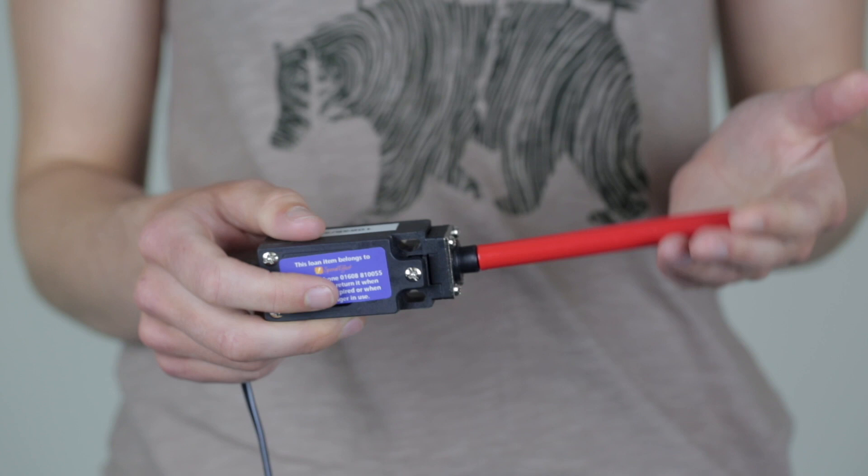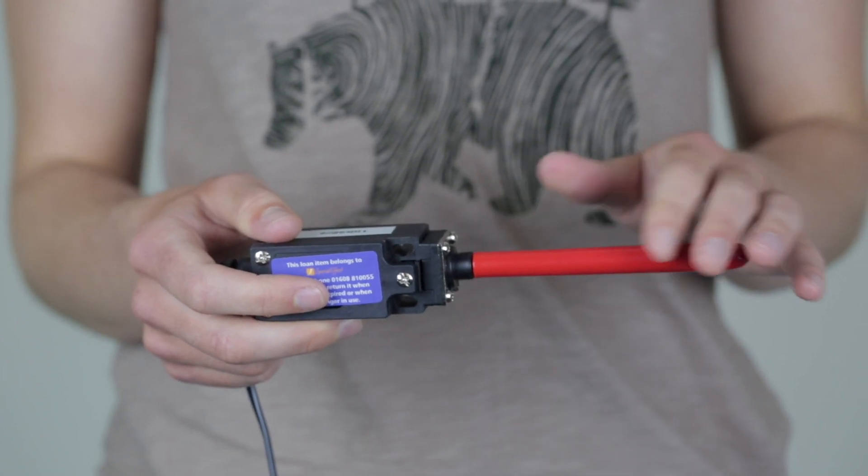Any accessibility switch with a 3.5mm jack should work in the Xbox Adaptive Controller. Here are some examples of other switches that we use at Special Effect.